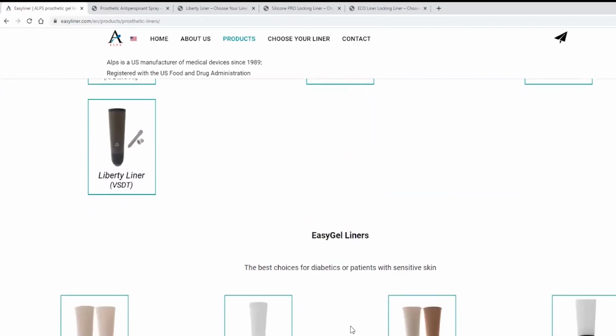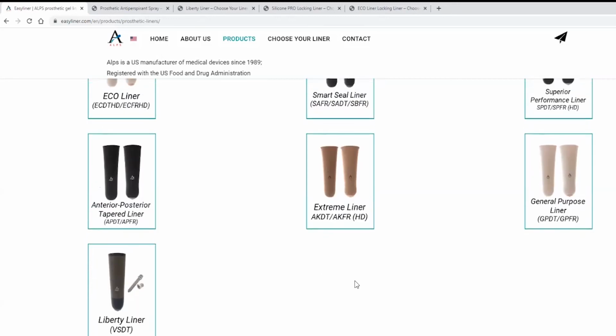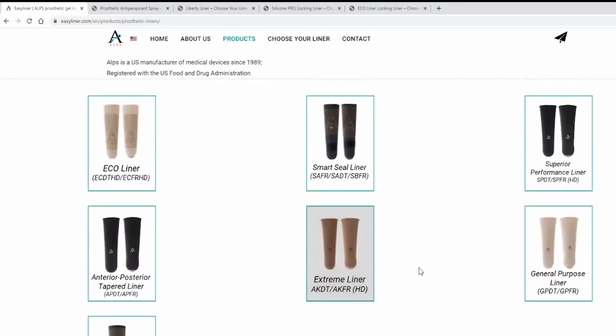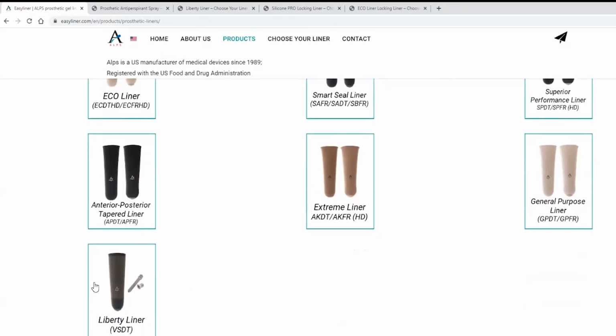Are you seeing a higher level of use in certain regions versus others, or does that really matter? Is it really patient specific? It really comes down to patient specific. One option may work for one person and may not work for another, and that's why we have so many different liners on the market. We have the different gel options: our easy gel, our HD gel, and those are all our TPE liners, but we do have the silicone liner. As we talked about earlier, that Liberty liner is great for that hot, steamy weather.